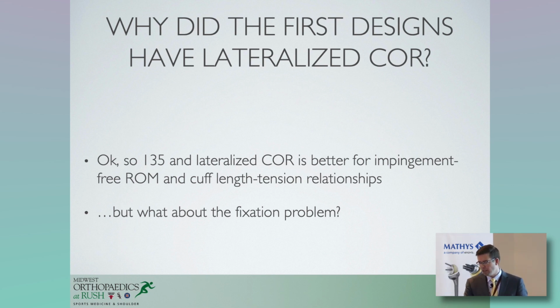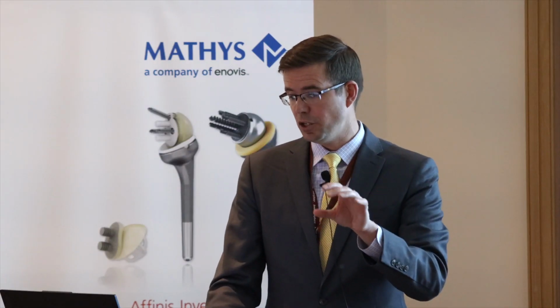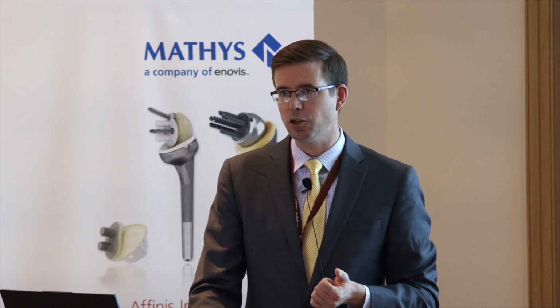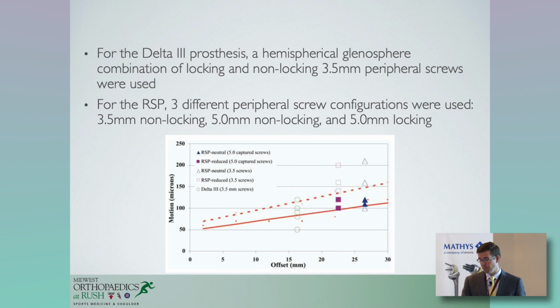So exactly as Philippe showed, this is a key study. When you have only a post and only peripheral compression screws, that's fine, it has to be a medialized center of rotation. But if you want to lateralize off the glenoid face, you have to use peripheral locking screws. But if you do that, this study shows you're going to get the same amount of micromotion, and then we've shown clinically the same amount of low base plate failure.